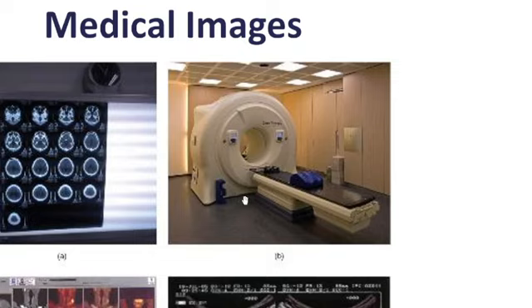The scan does not expose patients to large doses of radiation, unlike the CT scan. However, there's a drawback to this: it is very, very loud, and the tube might trigger claustrophobia.